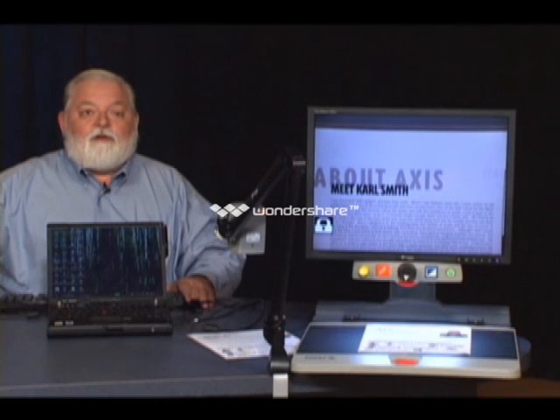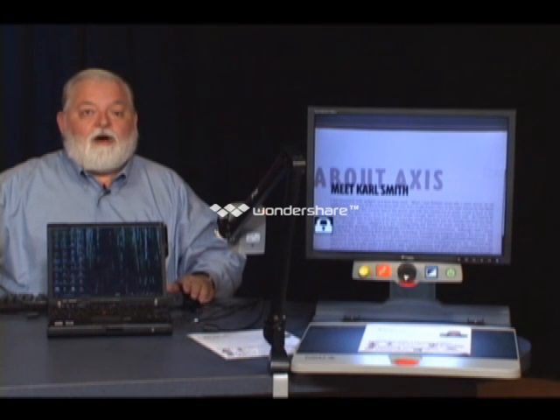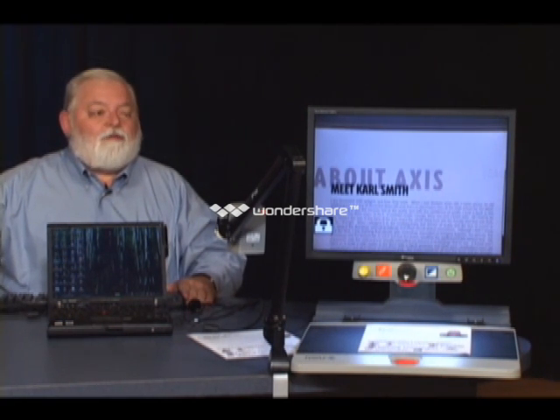A couple of things to do. Retinitis pigmentosa, if a person is to the point where they have to get the image that small, there's really not a convenient way to do it, because these machines don't make images any smaller than the real image is. If a person has got to the point where they can't read it unless it's smaller, it may be time to teach them something else, like to use a screen reader or to use Braille or something. It is not really easy to do.